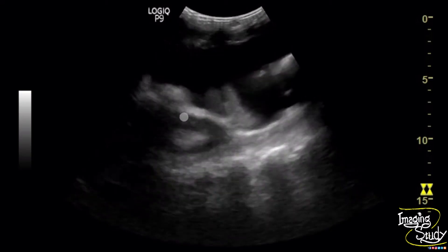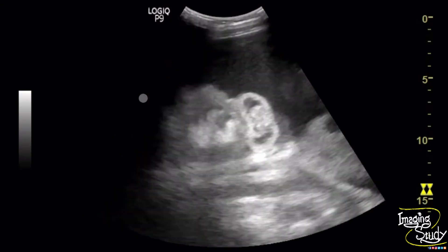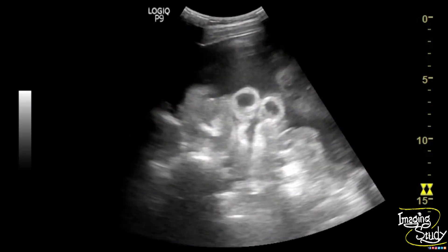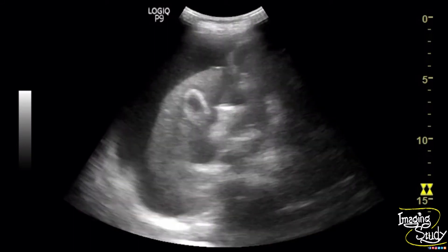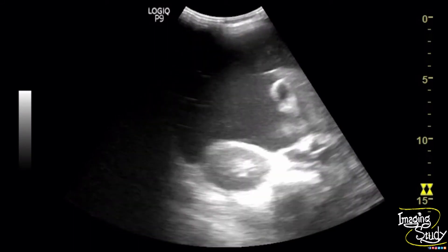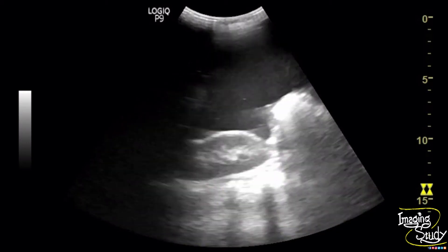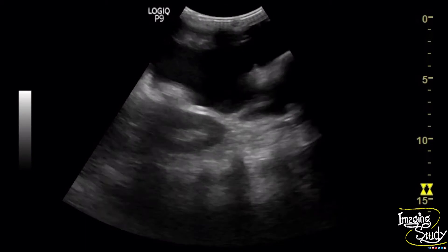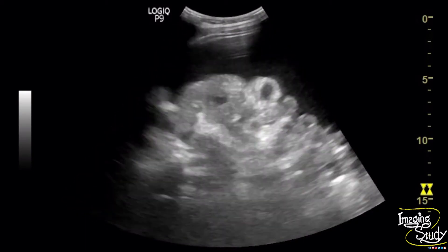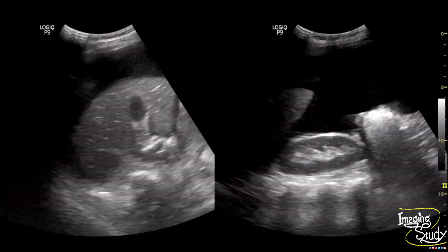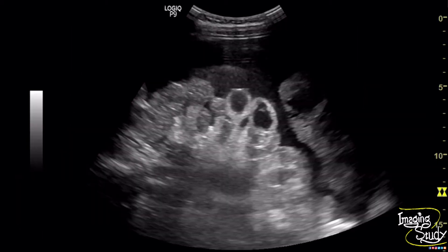You can see the small intestinal loops are floating within the ascitic fluid. Here is the picture of the gallbladder with liver and right kidney — you can see a huge amount of peritoneal collection. This is the picture of the small intestine floating within the ascitic fluid.